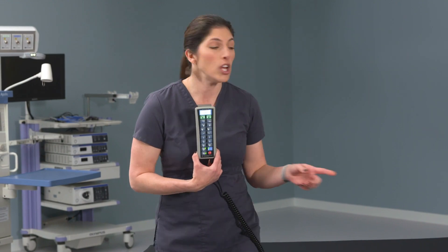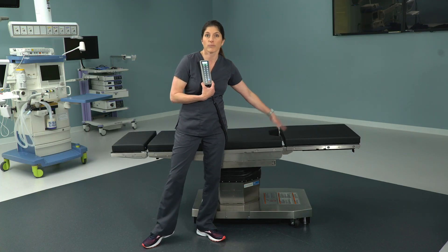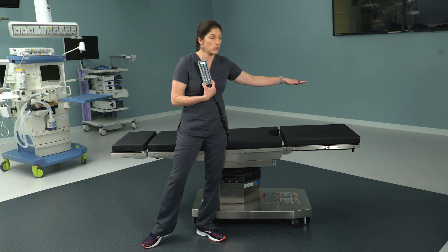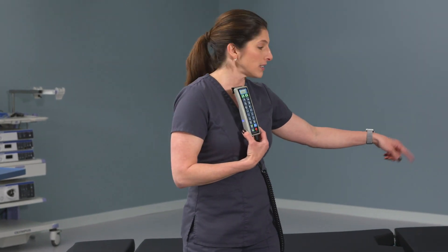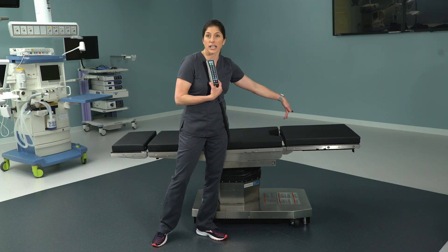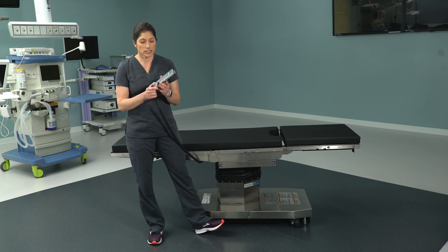The first is the beach chair: the leg section is removed and you apply the beach chair to the seat section, and the patient's head would now be at the normal foot end of the bed. The other is the 36-inch carbon fiber extension — the leg section is also removed and it applies to the leg receptacles at the foot end of the bed, and in that instance you would use reverse orientation.